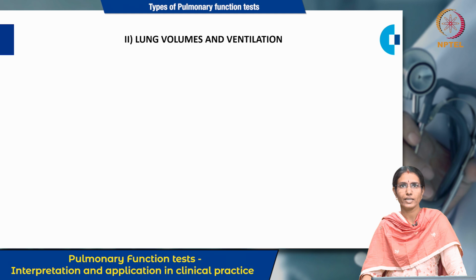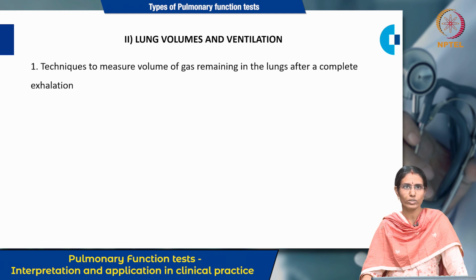And the other pulmonary function tests, we have seen about the tests of airway function, of which spirometry will be done for you in module 5. We have seen how to measure the inspiratory and expiratory muscle pressures, and then the tests of airway resistance and compliance. Put together, all these constitute tests of airway functions. The second classification of the pulmonary function tests is measurement of lung volumes and ventilation. So, what are these tests and how are they being done?